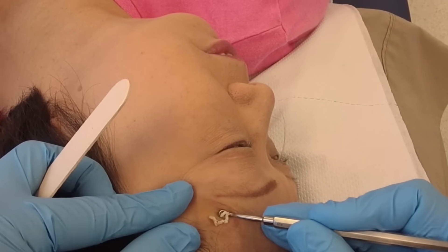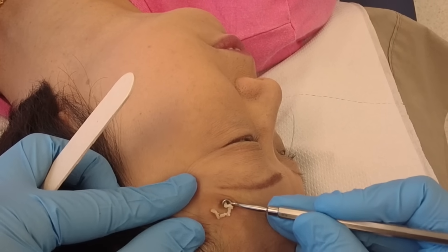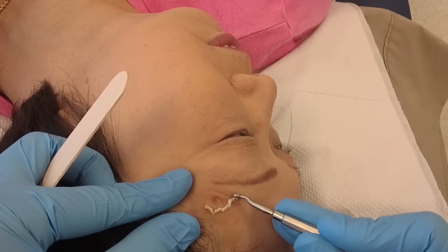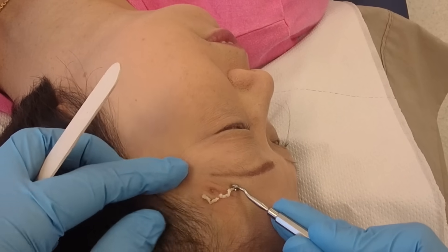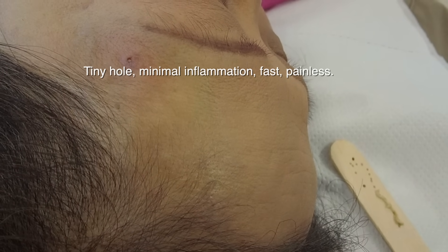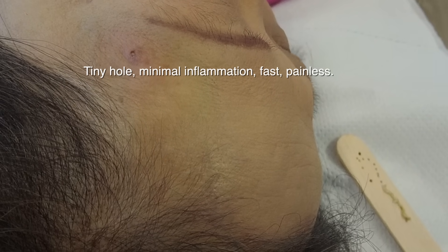This is not a cure, but it can certainly help extract the contents of the cyst. So there you have it — I got everything out, and you can see it's minimal collateral damage to the surrounding skin. That's why I like the laser method.